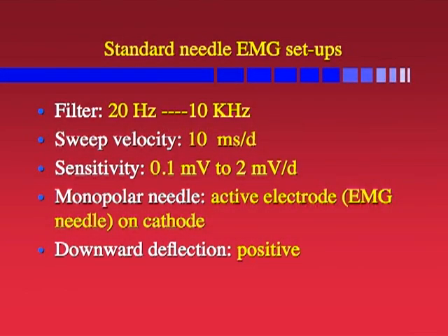Needle EMG waveforms. This demonstration of needle EMG waveforms is designed to show a typical example of each potential so that one is able to recognize a given EMG wave without any difficulty. The sound of EMG waves is paramount in recognizing the typical EMG waves. Often the characteristic sound of EMG waves permits recognition of these waves without looking at the waveform.